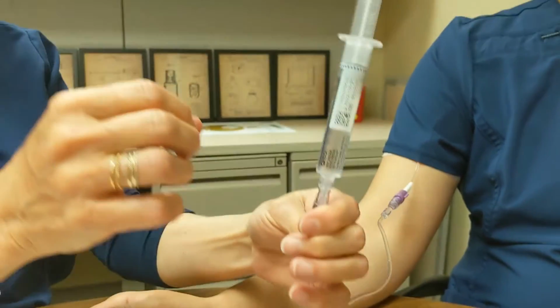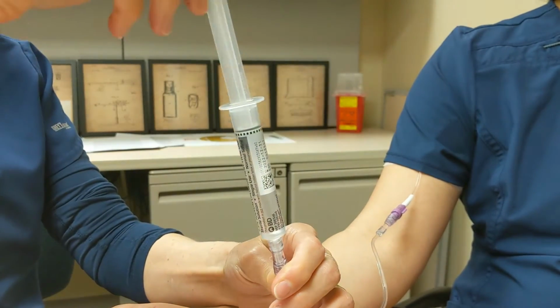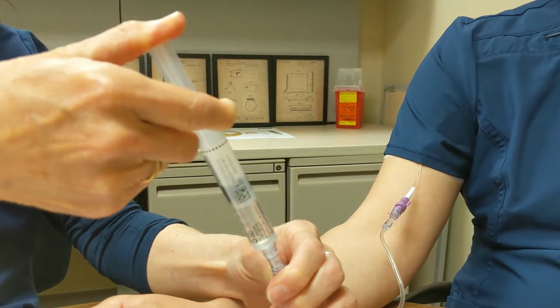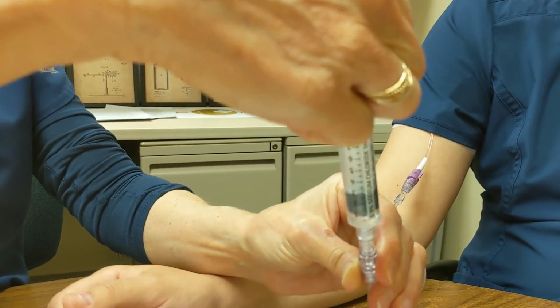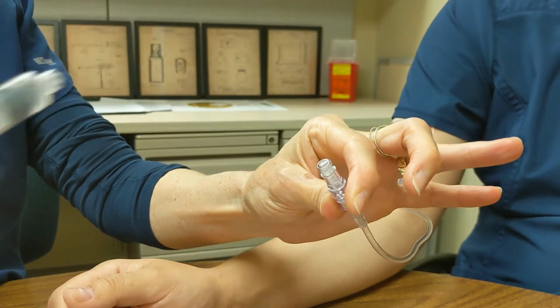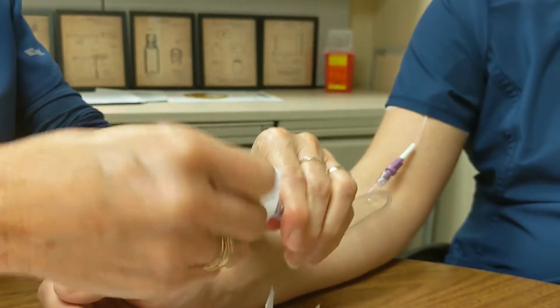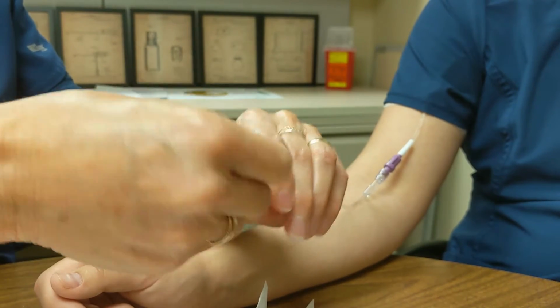If you notice air in the saline flush, tip the syringe with the plunger side up and tap the barrel with your finger so the air moves to the plunger end. Flush the catheter with 10 mL of saline. If you notice air, stop at the 1 mL mark, just shy of injecting the air bubble. Holding on to the ridged edge of the clave connector, remove the syringe with a slight twisting motion. Clean the clave connector again with an alcohol swab for 15 seconds. And be careful not to let the tip of the clave connector touch anything else.